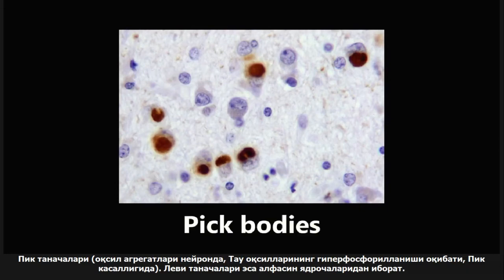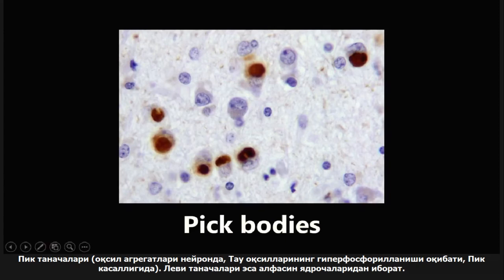This next one is an example of Pick bodies — protein aggregates seen in neurons caused by hyperphosphorylation of tau protein. You might confuse these with Lewy bodies, which can sometimes look similar. But the distinction is important: Lewy bodies are composed of alpha-synuclein, while Pick bodies are composed of hyperphosphorylated tau protein. Pick bodies are obviously seen in Pick disease.